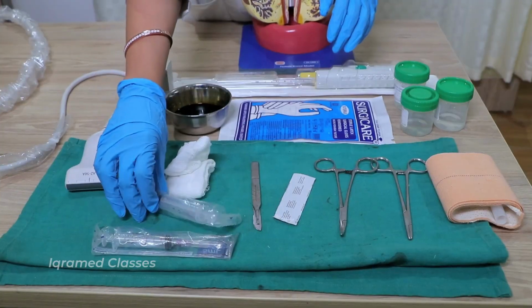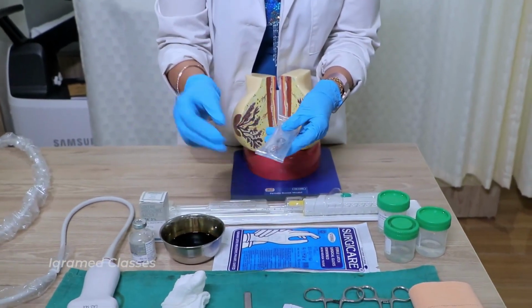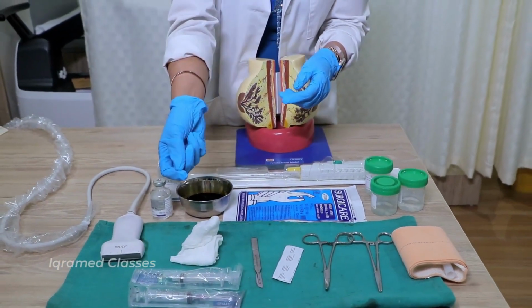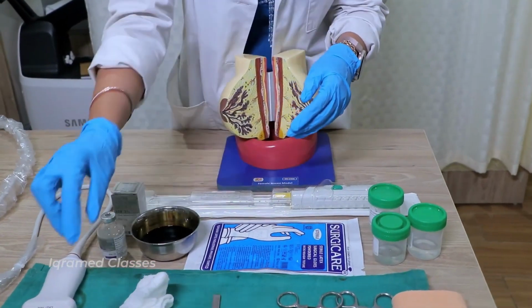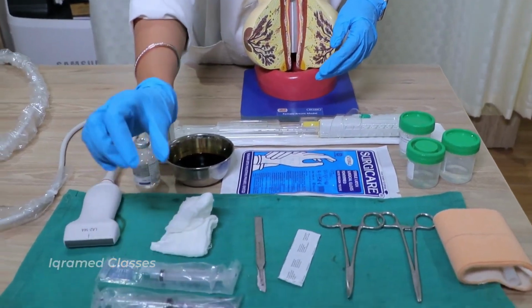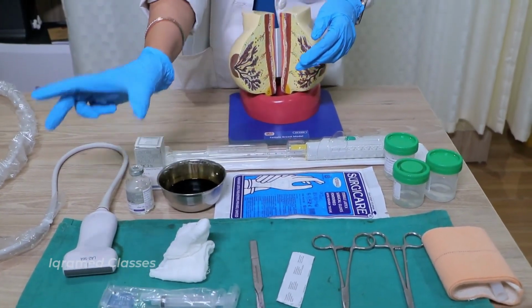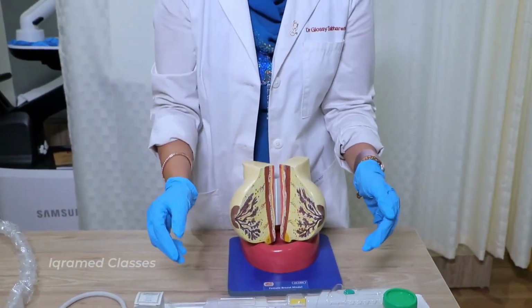Then you will pick up the syringe. Now you have localized where the lesion is, and with the syringe you are going to puncture the lesion and aspirate the fluid. We will show you how to do it. Just see the setup right now. In the syringe you will take the fluid and you will not pour the fluid somewhere else. You will send the syringe as such to the pathologist. This is for the fine needle aspiration.